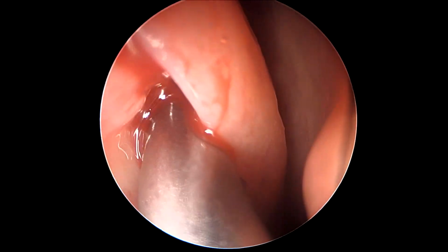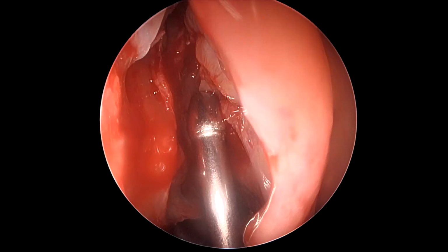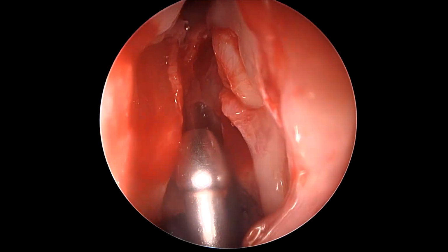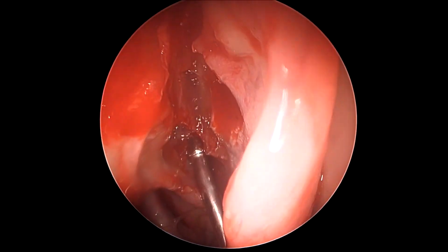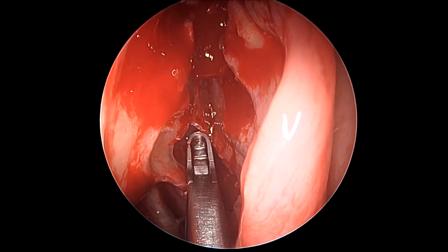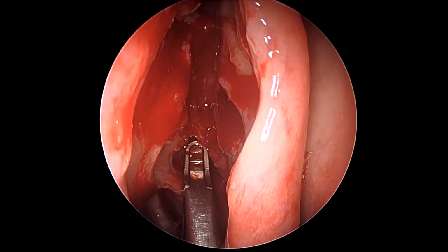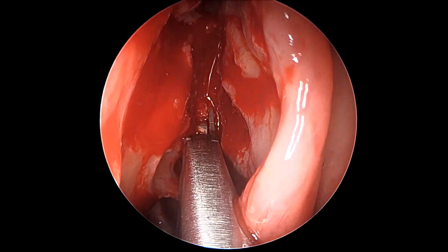So once again, post-dissection of the septations inside the frontal recess, we're using a thin suction to gradually and progressively increase our access towards the frontal recess region, and thus the sinus. Now again, we palpate and remove the ethmoidal septations, working our way from posterior to anterior, thus clearing almost all septations in the posterior, followed by anterior ethmoid region.